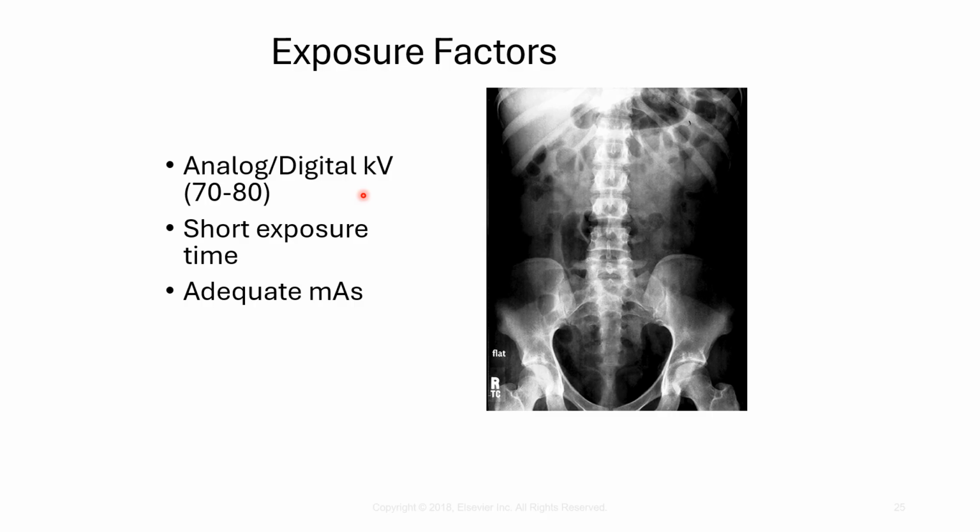We try to use a high mA and a short exposure time to reduce motion. And as always, we try to use high kVp, low mAs techniques to give a radiation sparing dose.